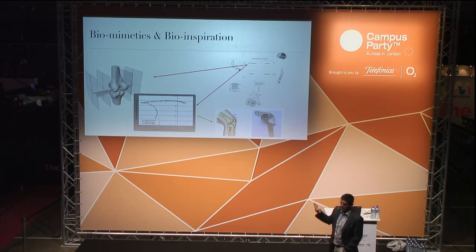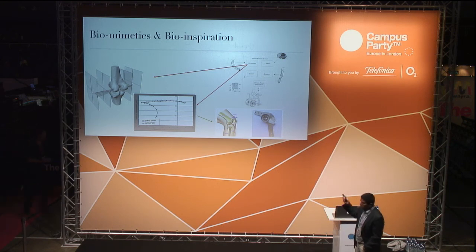So in our system, what we do is we developed what we call a four-bar mechanism, which is something equivalent. It is basically based on the cruciate ligament structure of the knee, which replicates this curve here at the level of the plane where we place the exoskeleton. So what is the result of this? The result is that we have a consistent and compatible kinematics at the level of the exoskeleton and of the human anatomy. Okay.